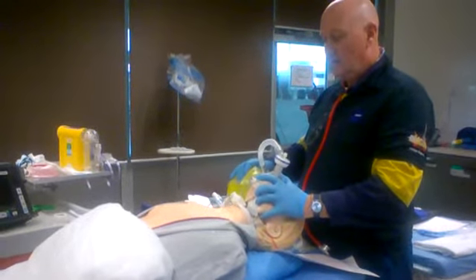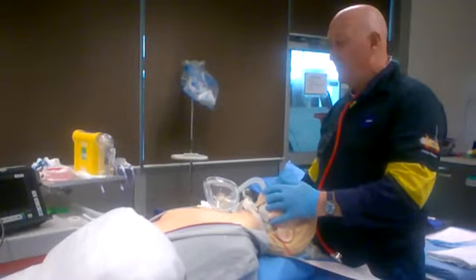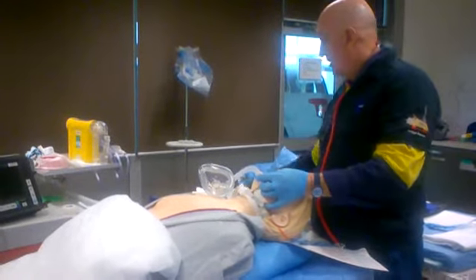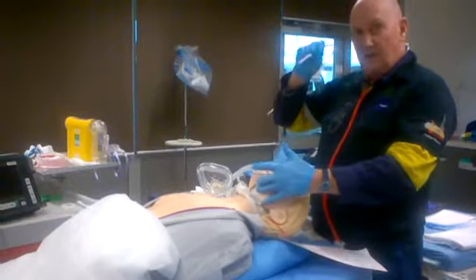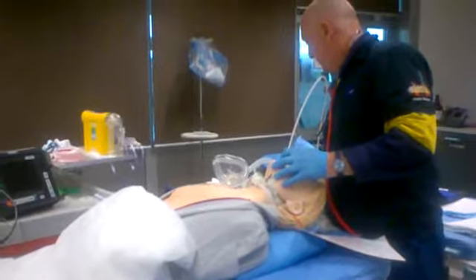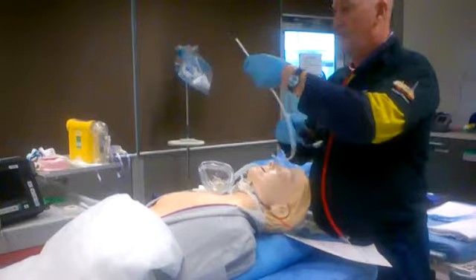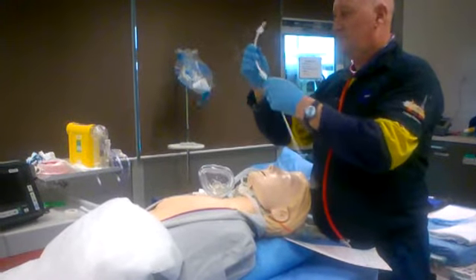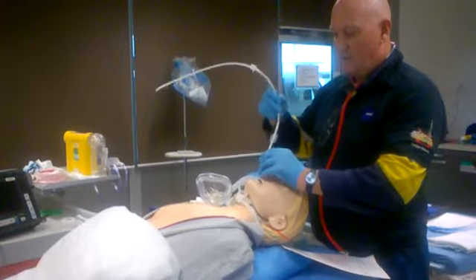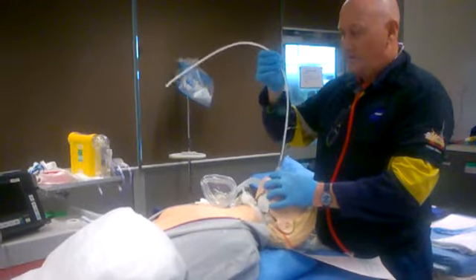Failing that, we then look for a video laryngoscope if we have it, to insert and have a better look down while the patient's still in that time frame, 6 to 10 minutes. Failing that, we then use our bougie with our tube prepared by our partner, to slide down inside the laryngoscope, and then the tube is fed off into the airway and sealed.